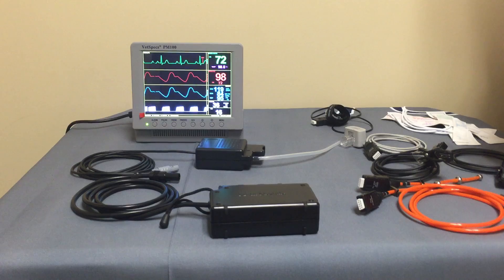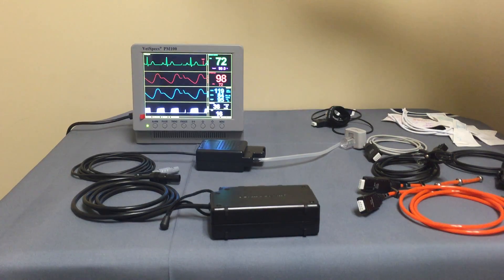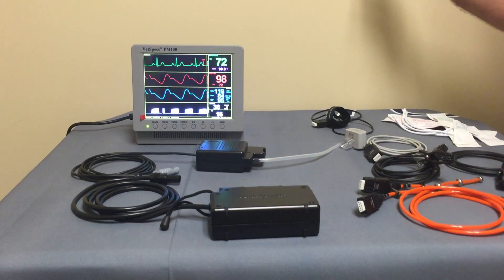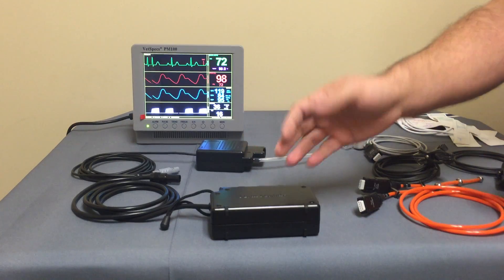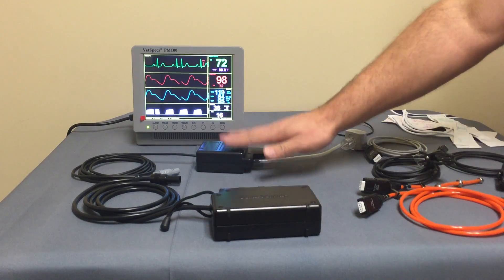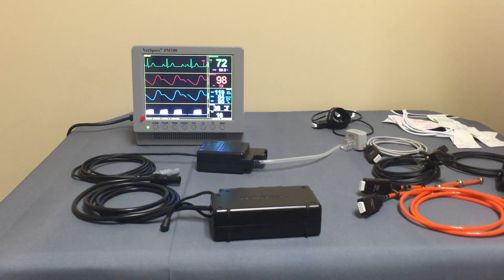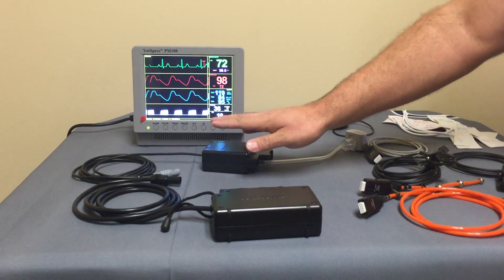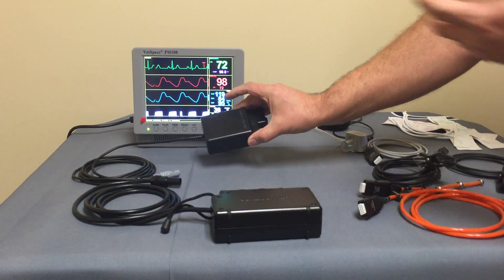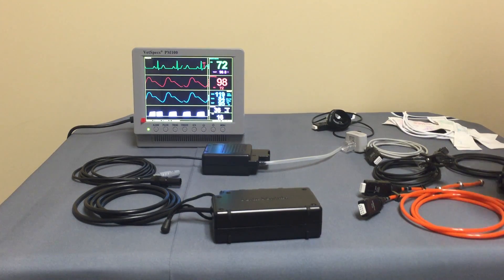Why would the modules be helpful? In the vet industry, veterinarians don't have multiple surgical monitors sitting around. If they happen to have an issue, by having an external module, VetSpecs is able to send a brand new module overnight and the problem is solved. Also, if there are any upgrades or technology changes, VetSpecs can literally just send a new blood pressure module to the customer and they're upgraded automatically.